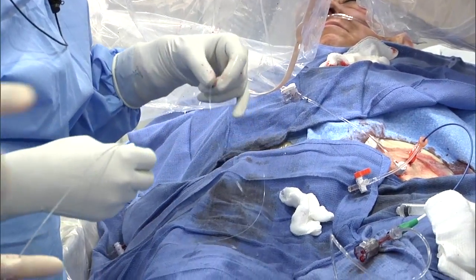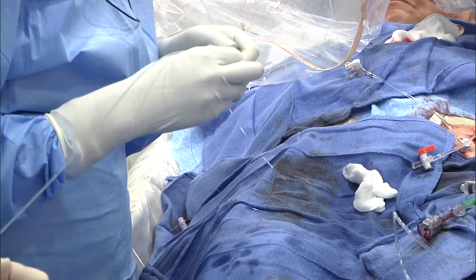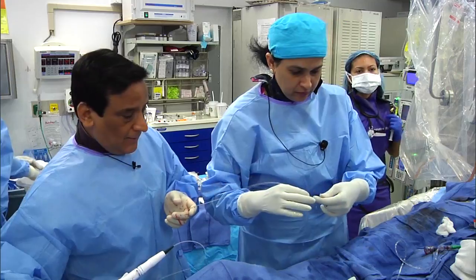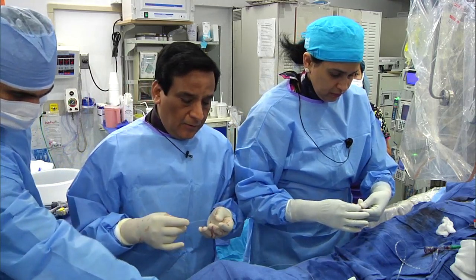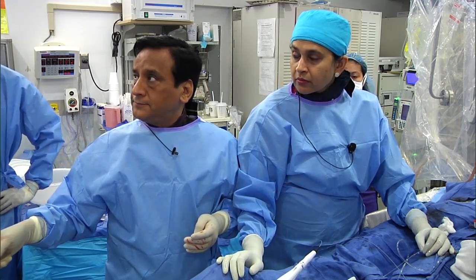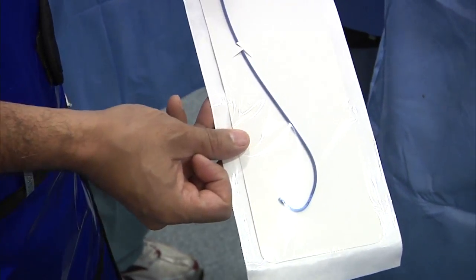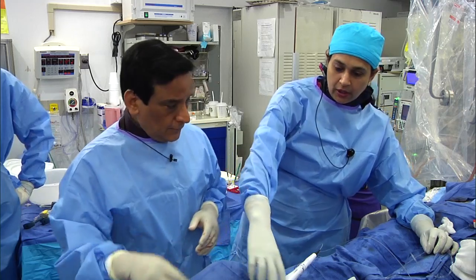Actually, why can't we bring one Shepherd crook to show the shape? Yeah, it's very nice. Similarly, Boston Scientific has the Voda Right, but I found it very aggressive, as it actually goes to the mid vessel, compared to the left-sided Voda, which is very good. The majority of our interventions are done using left VL. The whole EBU came from the Voda catheters. Yeah, show that on camera. It's a little upper takeoff, that's the advantage. Plus, with your secondary curve, you have more support.